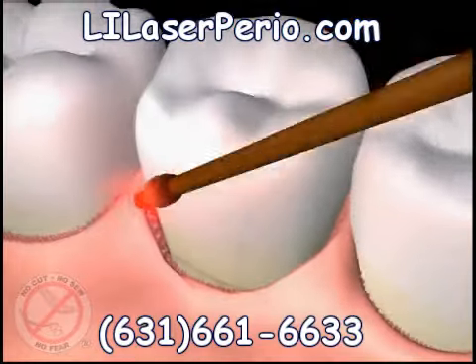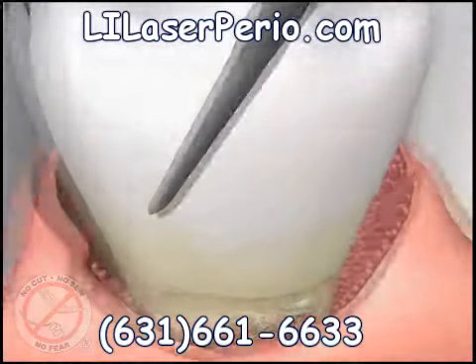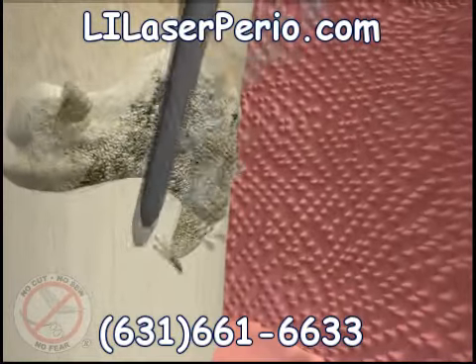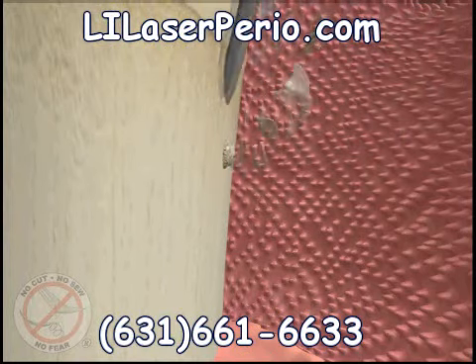The laser tip is then removed from the pocket and set aside. In the next step of the procedure, ultrasonic cleaners as small as a laser fiber tip are used to remove the hard deposits we call tartar or calculus from the top of the teeth and roots. These instruments use sound waves to vibrate and break apart the hard mineral calcium deposits, with water flushing away the debris and cooling the instrument tip.